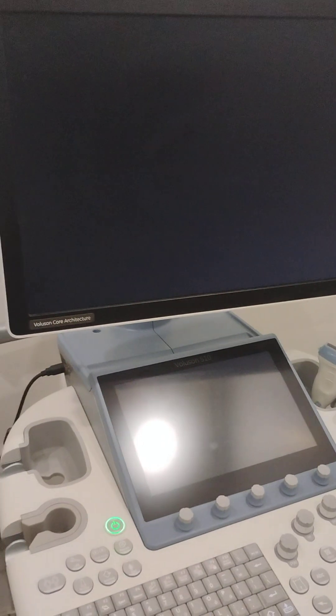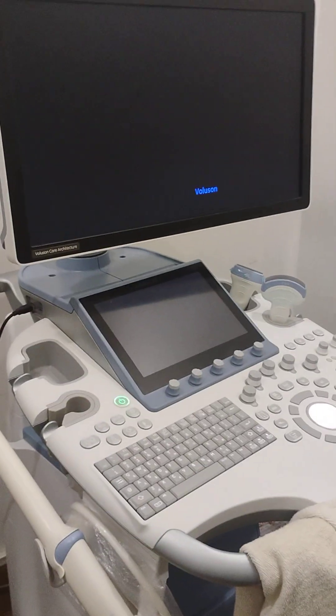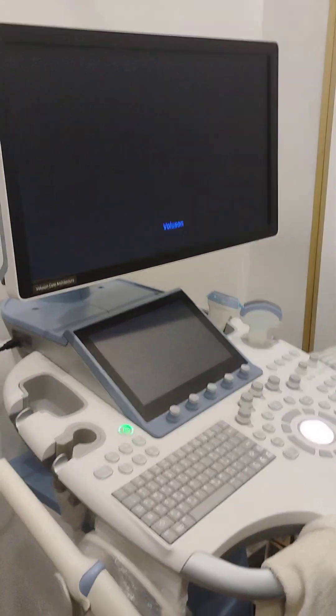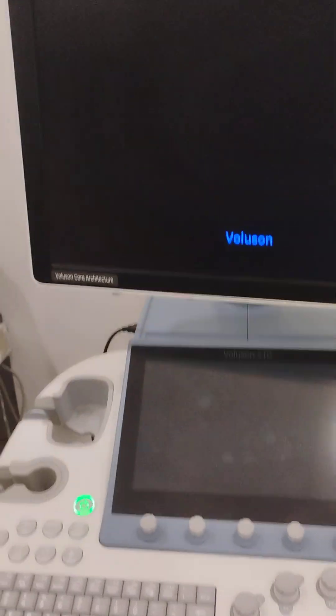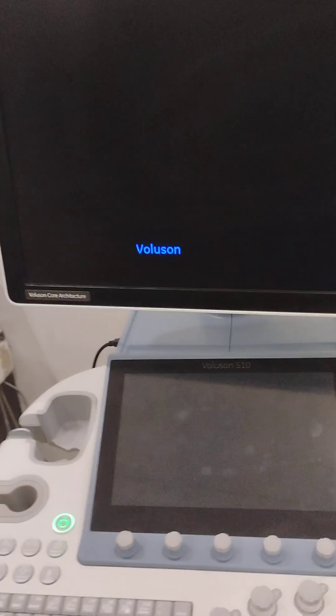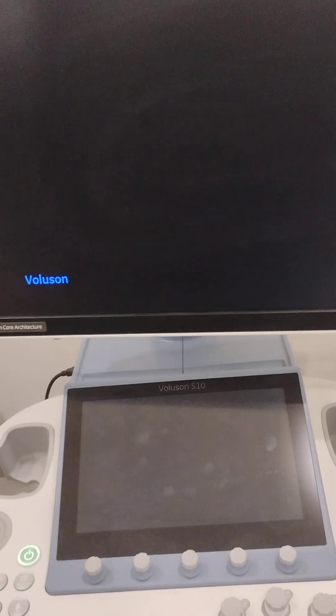I am going to show you how an ultrasound machine looks like. This is a beast from Voluson Core Architecture — that is the model name. This is the machine with which the doctor performs all the ultrasound tasks and tests. Although there are various models and various kinds of machines made for different kinds of ultrasounds, this is how a general ultrasound performing machine looks like.